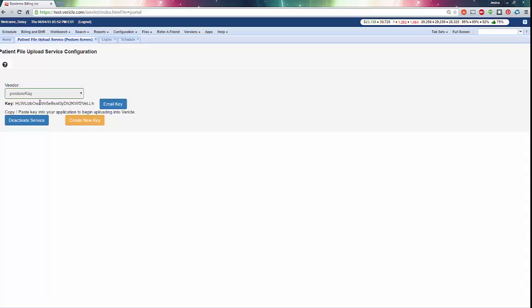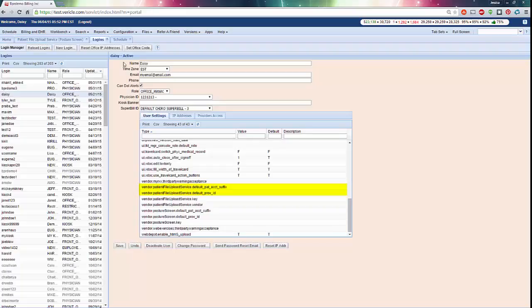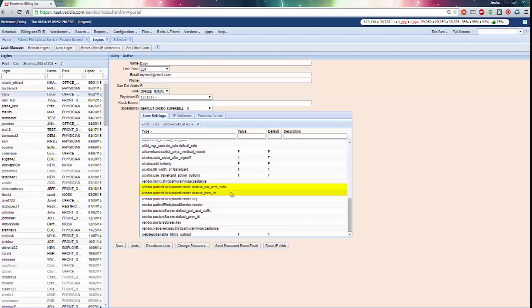If you use multiple patient accounts and or have access to multiple practices, you can set default account ID suffixes or a practice ID that the system should look at to upload the file to.